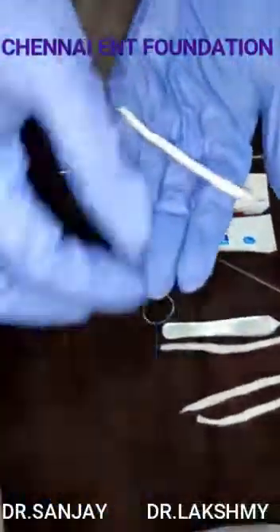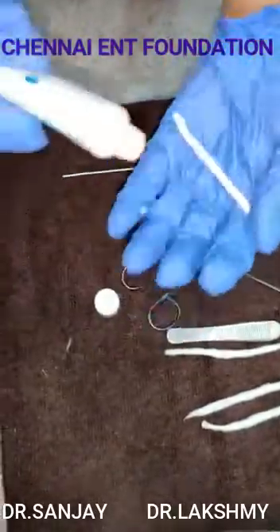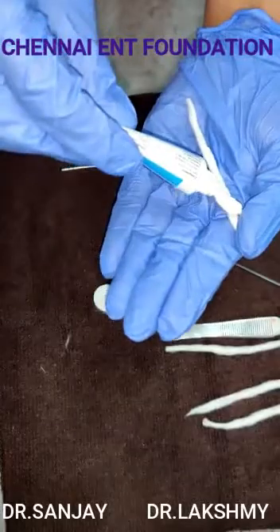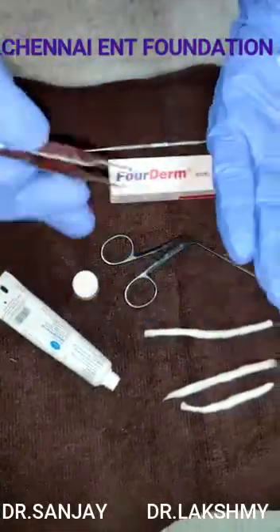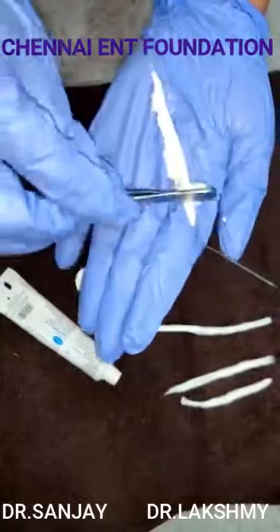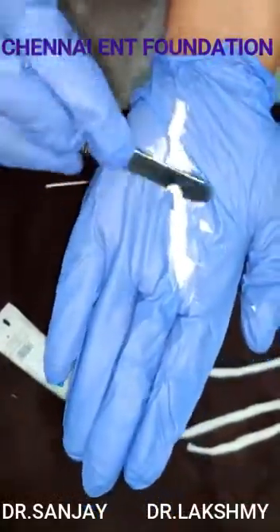you can take the cotton wick on the palm of your hand and spread the ointment liberally on the cotton wick. As you can see, I am spreading it liberally on the cotton wick. I'm using the back side of a tooth forceps here to spread it. At home, you can use any clean silver spatula or the back side of a spoon.